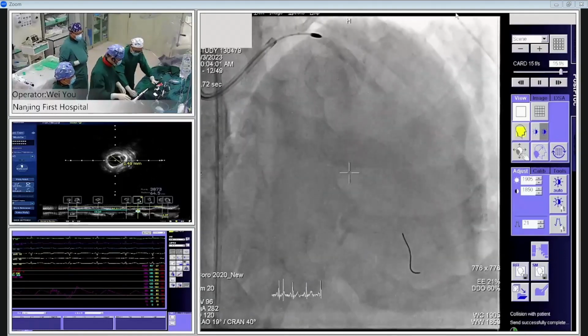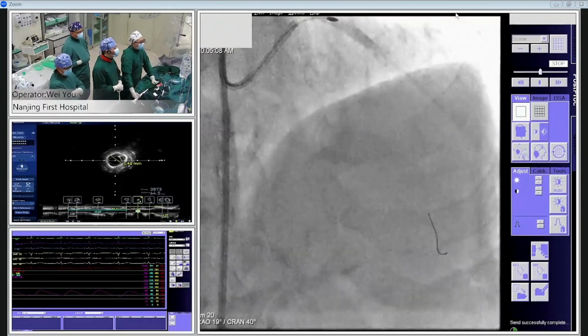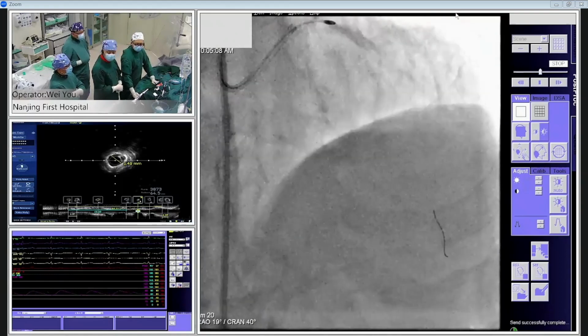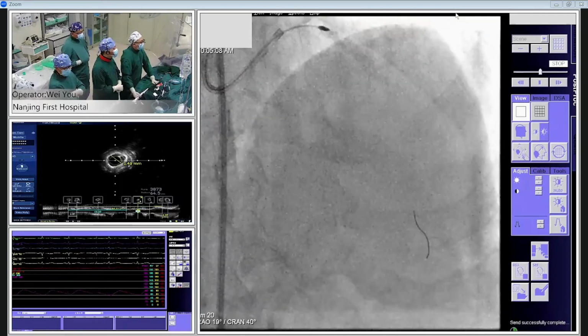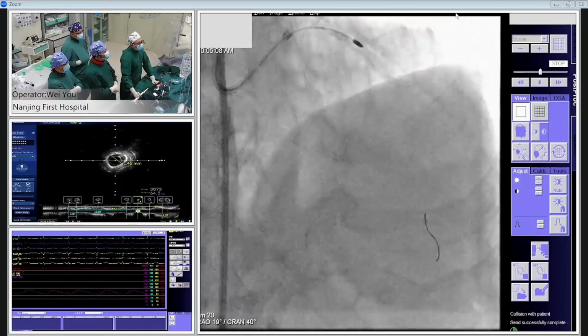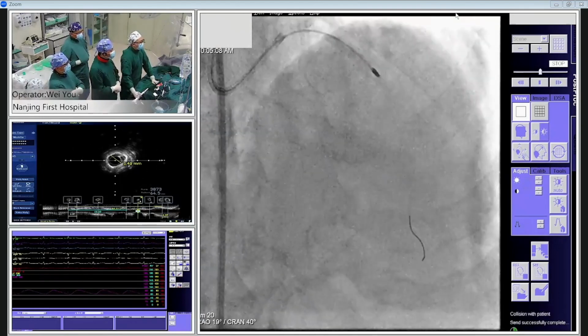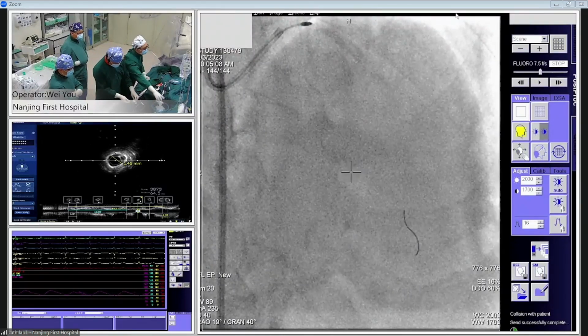After the polish. Okay, reduce the speed to 140,000. OK, we use the low speed polishing for seconds. No speed deceleration, right? Okay, very smooth. 15 seconds. Okay, I think we can finish, Chip.